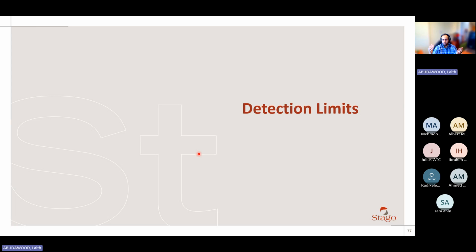So I'm transferring the range from their lab to mine, but I'm verifying it before I use it. This is the least you can do for reference range verification. It's acceptable, but it's the least you can do. There are better things, but this is what is most commonly used. Did I answer your question, Ibrahim, or are you looking for a different point? Yeah, you answered. Thanks. You're welcome. If you want to discuss this in more detail, I can send you the part of the CLSI document that answers this question, because there are some minute details that maybe you should know.